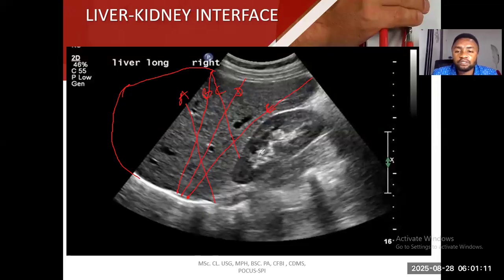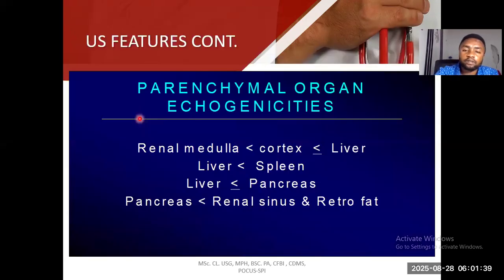So have you seen the right kidney there? That's it. So everybody will know that indeed this is a huge organ. And once we are seeing the kidney there, we know that's the liver. If this mass over here was to be a bit small, we know that it's the spleen, so this kidney will be the left kidney. Do you understand? All right. So let me move back.